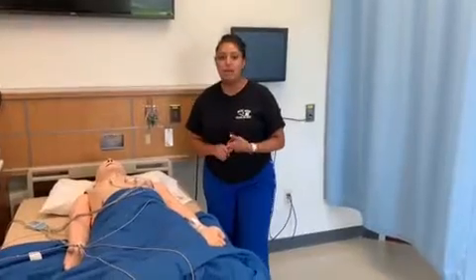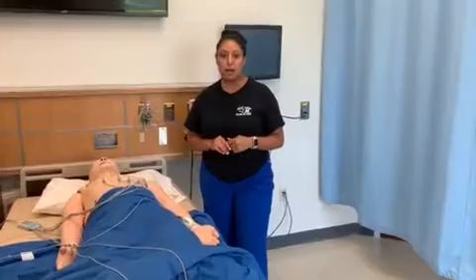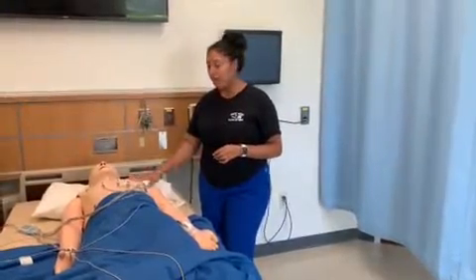Also, you want to keep in mind that if this person has any pacemakers, defibrillators, chest tubes, any central line ports, or any external defibrillator pads, you don't put the electrodes over those.